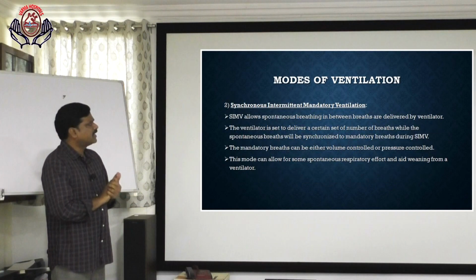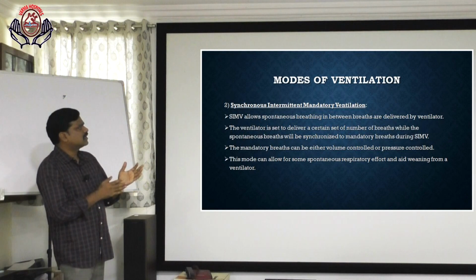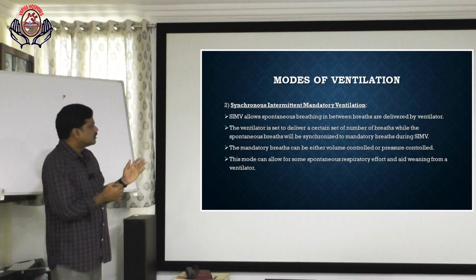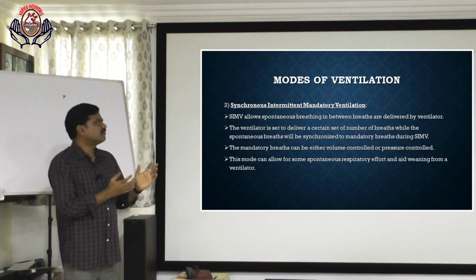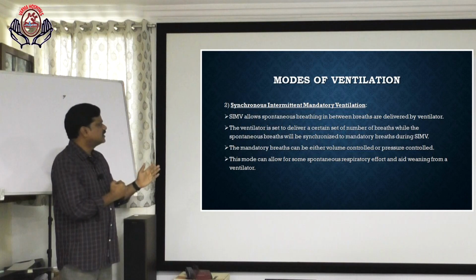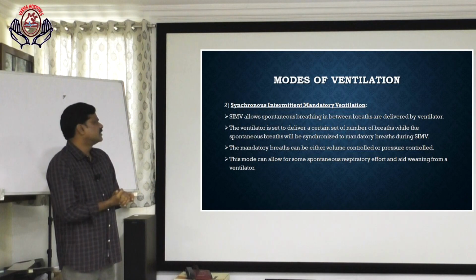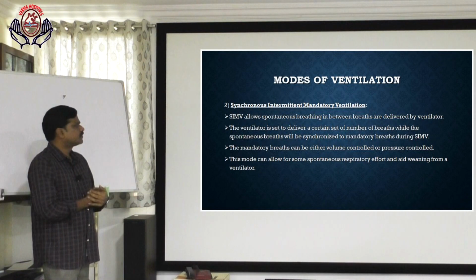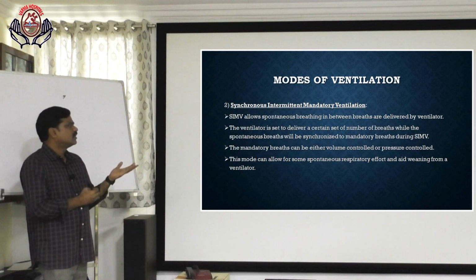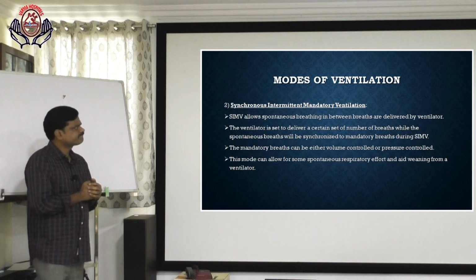Synchronized intermittent mandatory ventilation, SIMV, allows spontaneous breathing in between breaths delivered by the ventilator. The ventilator is set to deliver a certain number of breaths, while the spontaneous breaths will be synchronized to mandatory breaths during SIMV. The mandatory breaths can be either volume control or pressure control. This mode can allow some spontaneous respiratory effort and aid weaning from the ventilator.